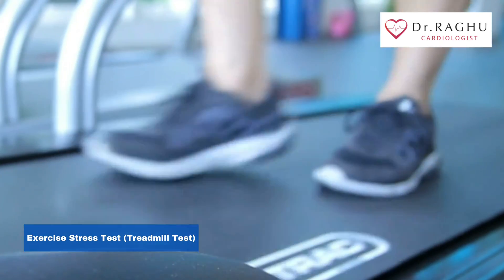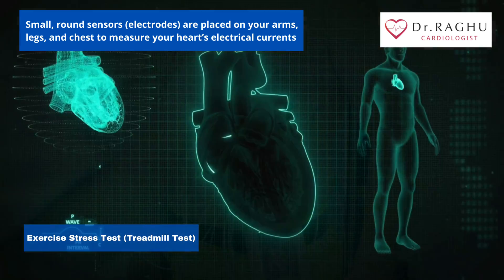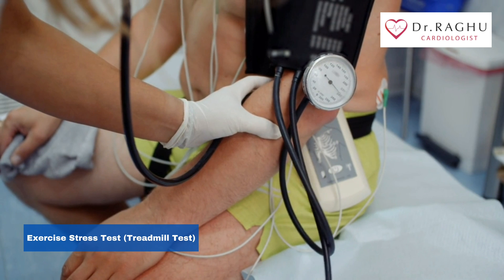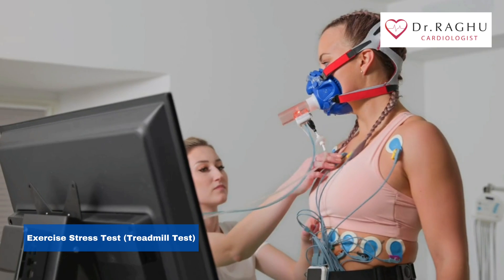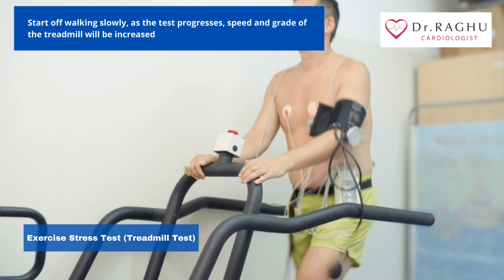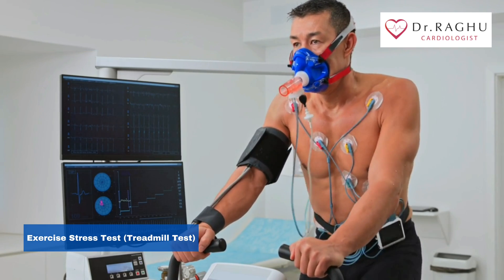Before you begin exercising, you'll be hooked up to the ECG machine. Small round sensors are placed on your arms, legs, and chest to measure your heart's electrical currents. You'll wear a blood pressure cuff on your arm. Your doctor or nurse will check your heart rate and breathing before you begin exercising. Your doctor may also have you breathe into a tube to test the strength of your lungs. You'll start off by walking slowly on a treadmill, and the speed and grade of the treadmill will be increased as the test continues.